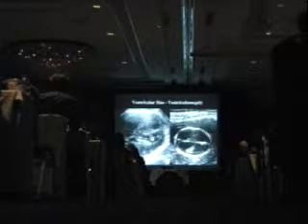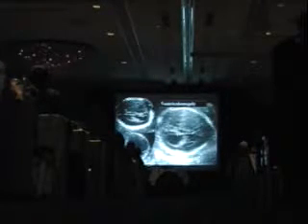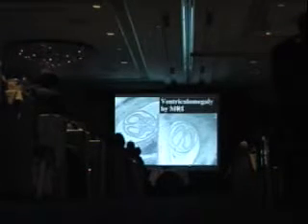And you can take a look at this and suspect very strongly that the ventricles here are too big. You throw calipers on it, and sure enough, it is. But you can see that the choroids are very convenient in that they show exactly where to put your calipers. Here, they're both actually hanging down the same side, which is unusual. But it is a great marker to know exactly where to measure.